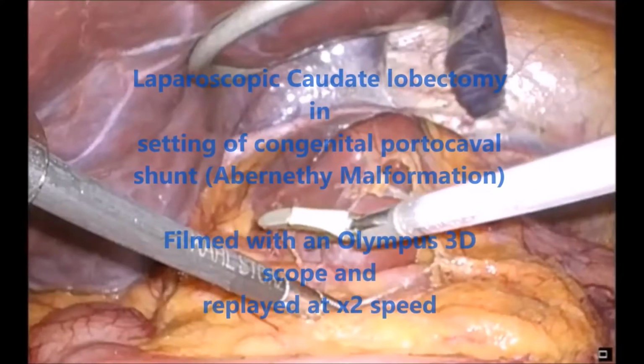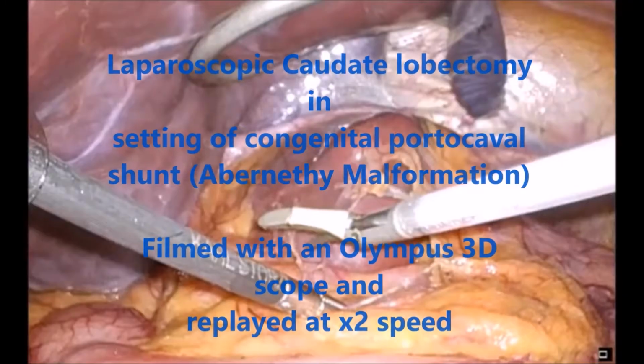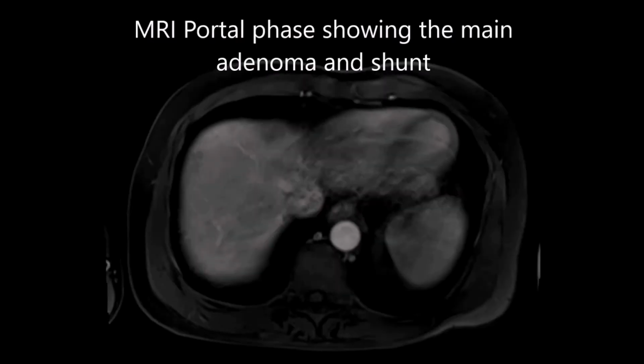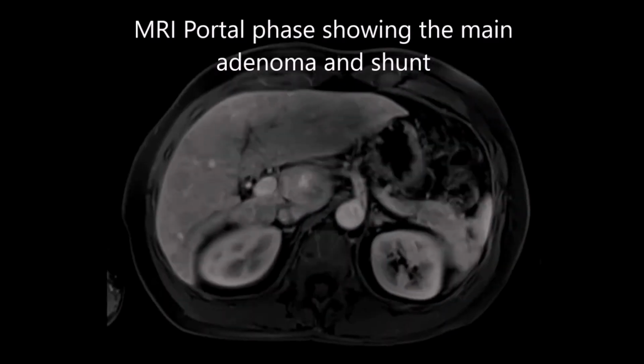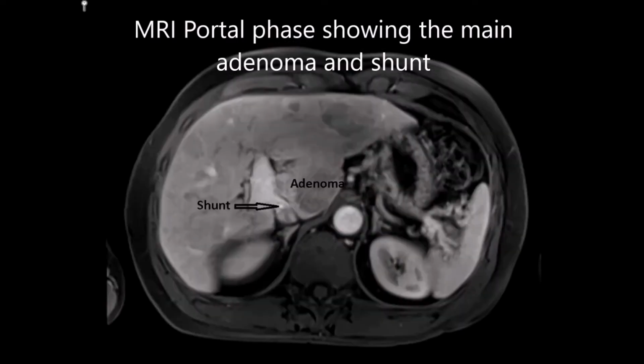This is a case of a laparoscopic caudate lobectomy in a gentleman with Abernethy malformation for a large adenoma associated with this problem. His preoperative workup was otherwise unremarkable. He'd had a rapid increase in the size of one of his adenomas in the caudate lobe, seen here on the MRI scan, in close proximity to the shunt.